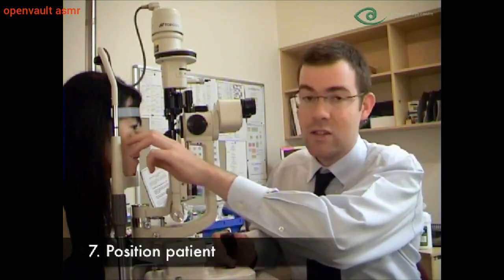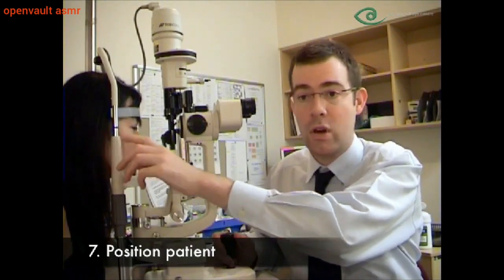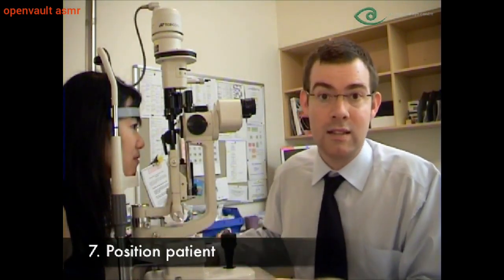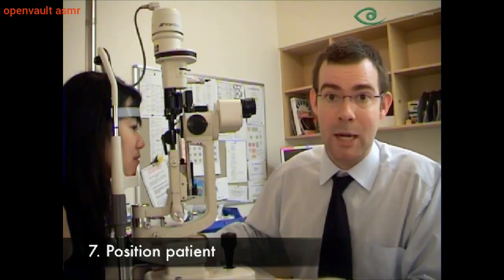Also make sure that the patient's lateral canthus is aligned with the black bar. If it's not, adjust the height of the chin rest accordingly. You can also adjust the height of the table or the chair as needed for the patient's comfort. You're now ready to begin your examination.